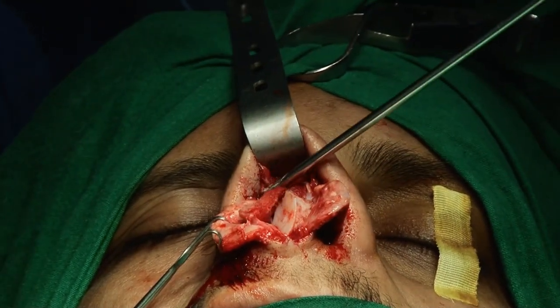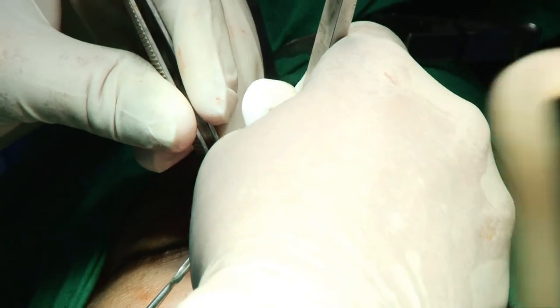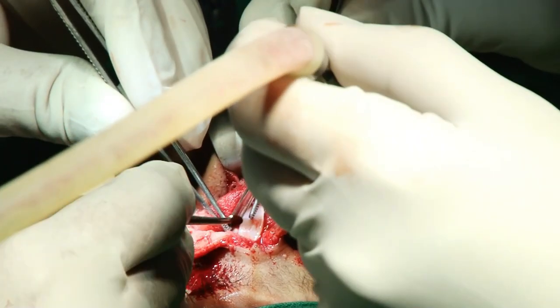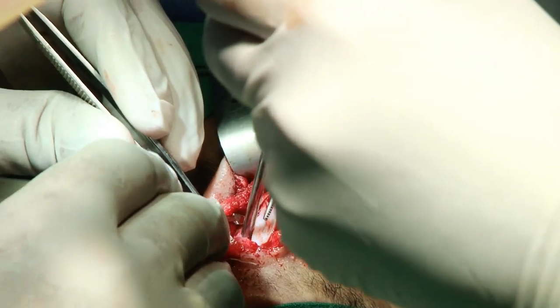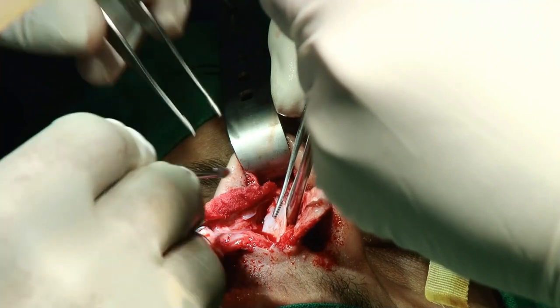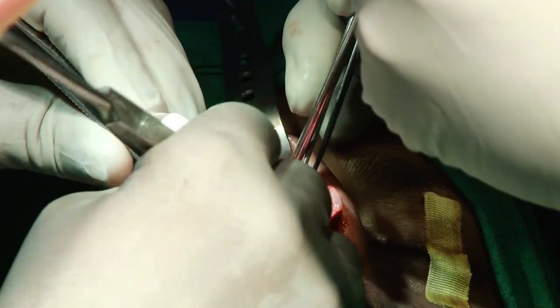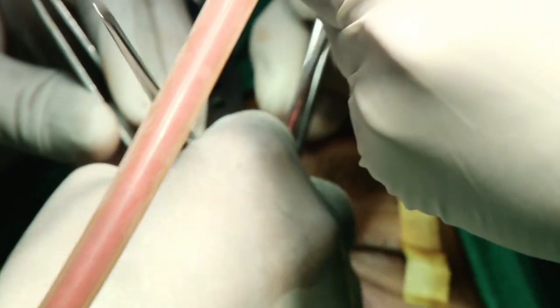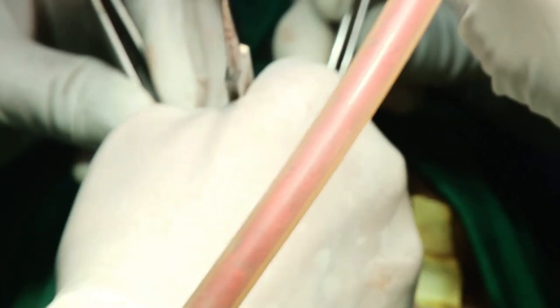Suction. Okay. Yes. So now we complete the mucoperichondrium elevation, for the septum to cut low. Because the septum looks buckled here. We have a little bit here, but now you find the right plane. So whenever you deglove your mucoperichondrium, one side is concave, one side is convex. This is an important lesson for my beginner friends. Then you expose first on the concave side, so at least you preserve one side. My sequence is the same: the posterior inferior, then posterior superior, and last the anterior inferior.